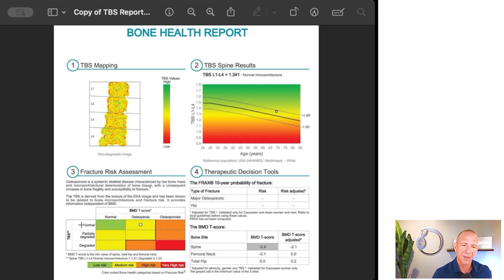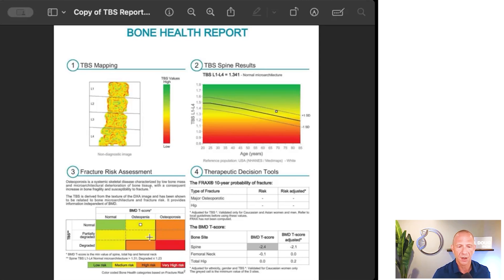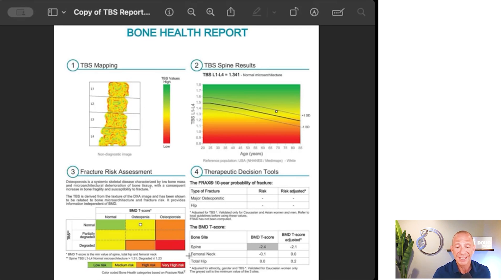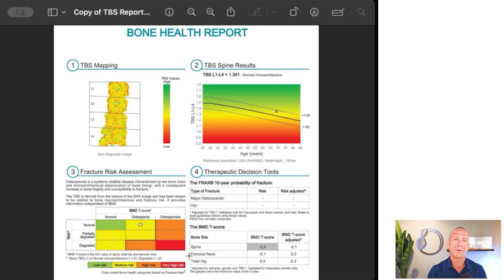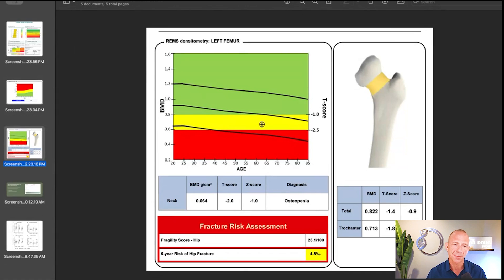This particular patient has osteopenia with a normal TBS — which is really good. But the reason I don't find TBS particularly helpful in practice is that I so often see people with osteopenia or osteoporosis and partially degraded bone, and it doesn't change what I'm going to do. Even if this patient's TBS said partially degraded, my recommendations would be the same: improve her bone and continue her on her path. So TBS could be helpful in some cases, but it doesn't necessarily change clinical recommendations, so we don't routinely request it.